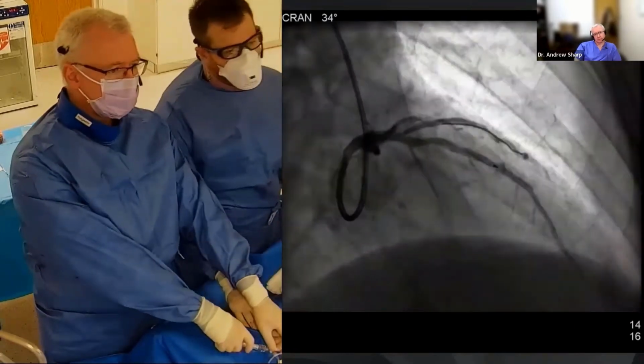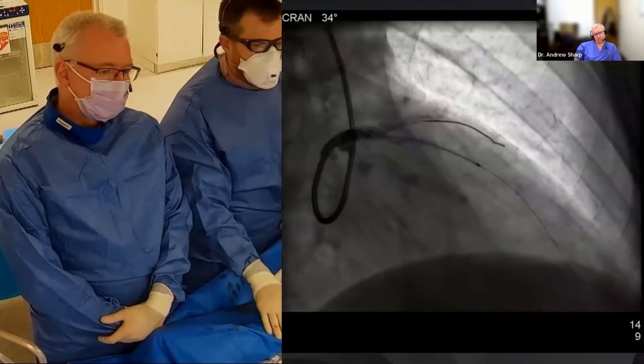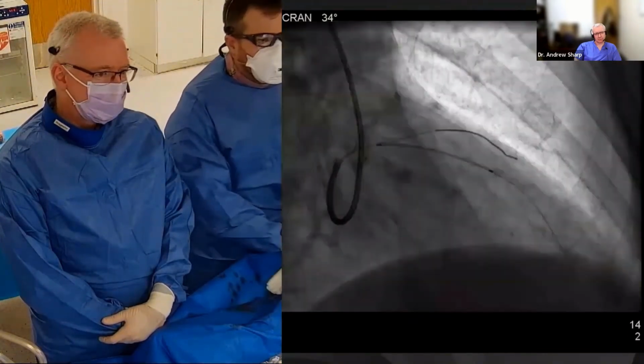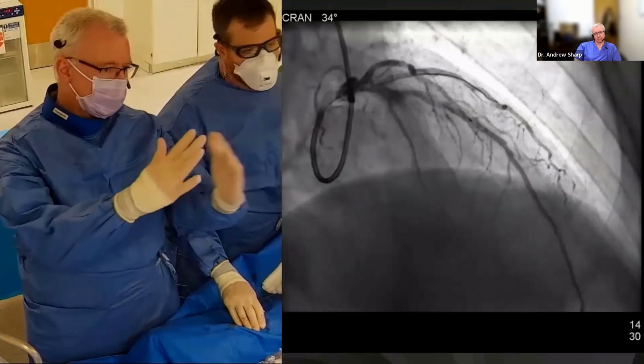Just needs a millimetre forward, do you think? No, I think on the IVUS we were pretty sure that we had that area there where it was slightly ectatic, and actually we had relatively normal vessel proximal. So I'm okay coming a touch more proximal. And the Zions is mid marker. Mid marker. So if we're looking at that distal mid marker, we've got that ectatic segment.